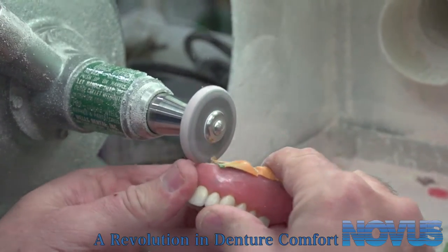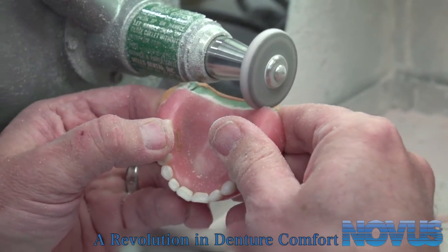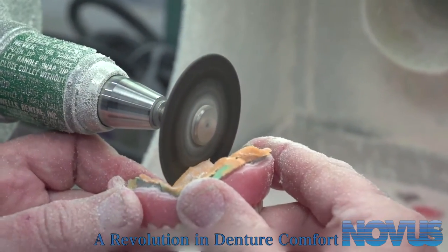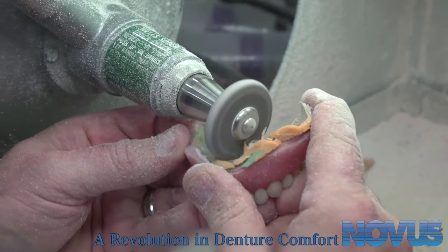Next, prepare the host denture by removing most, if not all, of the denture acrylic, like a rebase. This step is not necessary when processing a new denture.